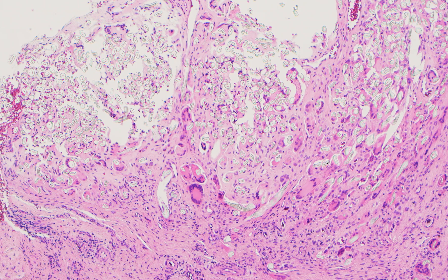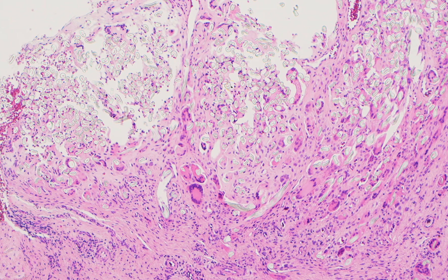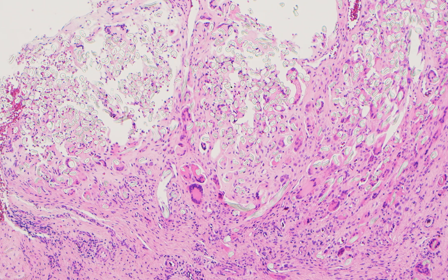Here's an example: when I flip the condenser off, it makes these structures stand out as way more three-dimensional. Anytime there's something that has kind of three dimensions or a sharp border or contrast — particularly foreign material, or if you're looking at the epidermis and want to see the outlines of keratinocytes — flip the condenser off and it will make it stand out more.